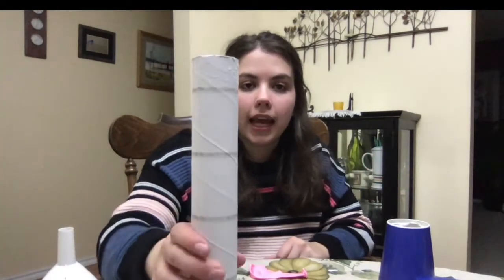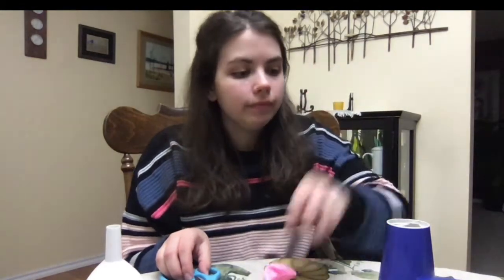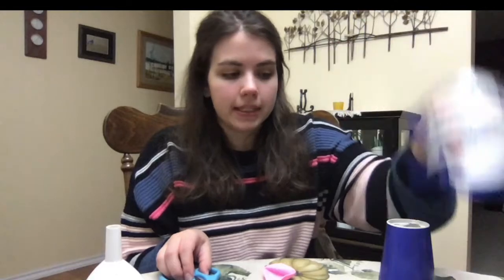So for our homemade version, we're gonna need a few things. We're gonna need, I'm using a paper towel tube, but it doesn't necessarily need to be that. Just something tube-shaped that is gonna be stiff. We're gonna need a funnel. So any size you have lying around will do. We're gonna need a pair of scissors. We're gonna need a balloon. And we're gonna need some tape.